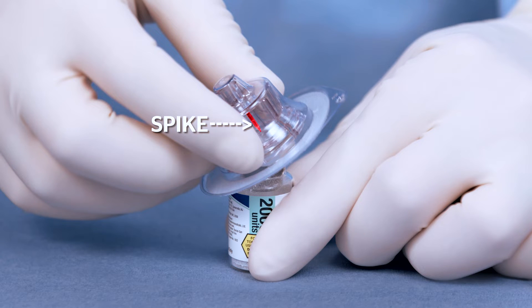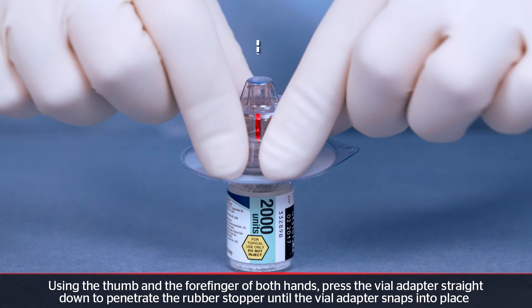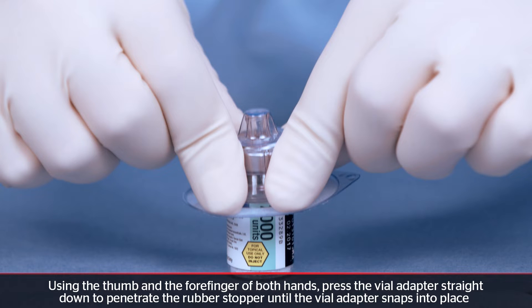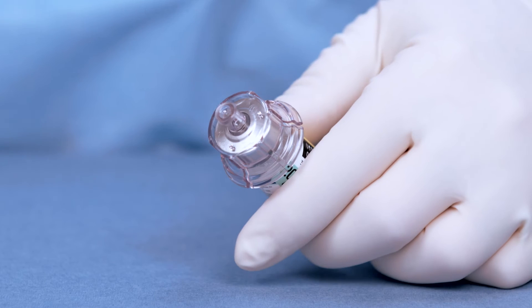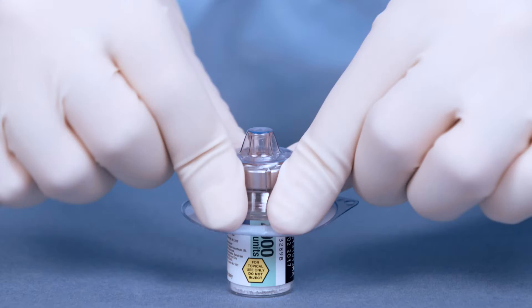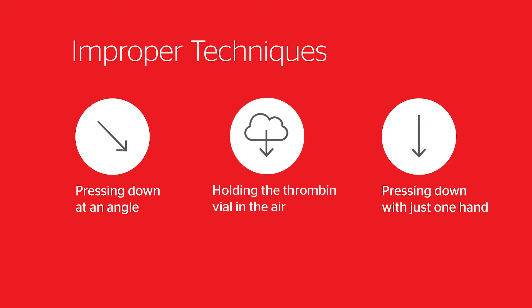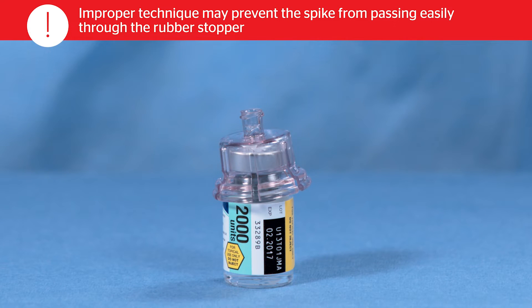On a flat surface, seat the vial adapter on the thrombin vial by pushing down using the thumb and forefinger of both hands until the spike penetrates the rubber stopper and the vial adapter snaps into place. Improper technique may prevent the spike from passing easily through the rubber stopper.